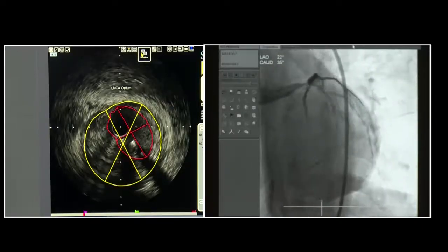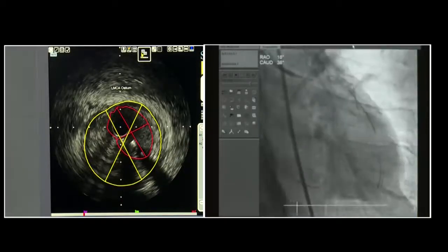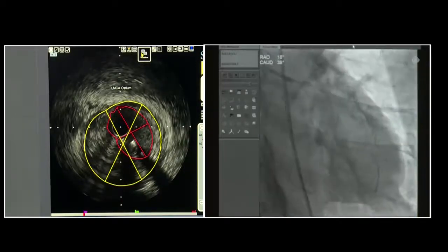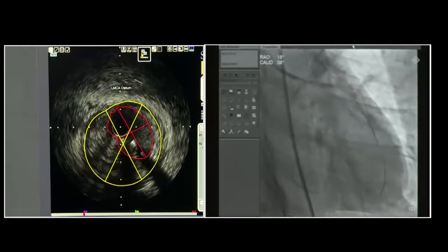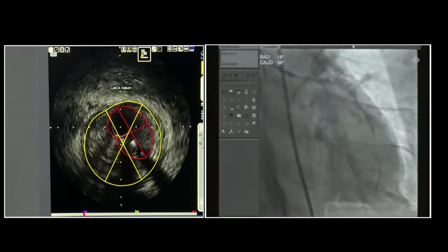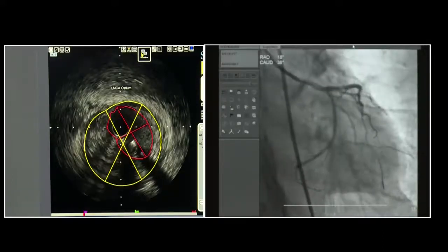Yeah. If we want to go ahead with a two-stent technique, which technique? Angiographically, can we show the runs, please? Next runs. Let us just show that we did a dilatation in the area of interest with a 3.5 NC balloon. We went up to 20 atmospheres. Next. So that's how it looks. It looks better. There is no area of dissection.